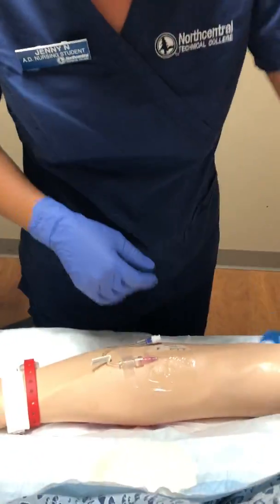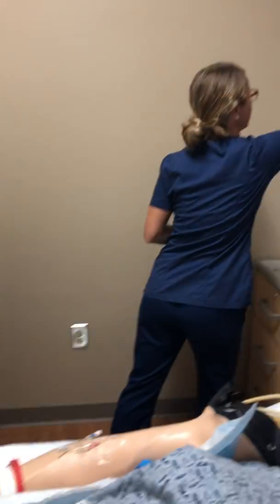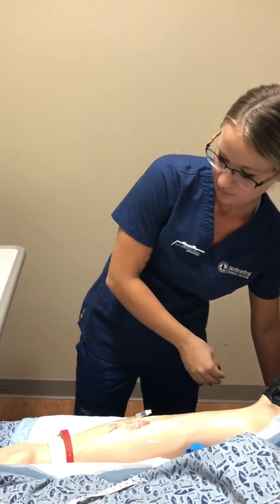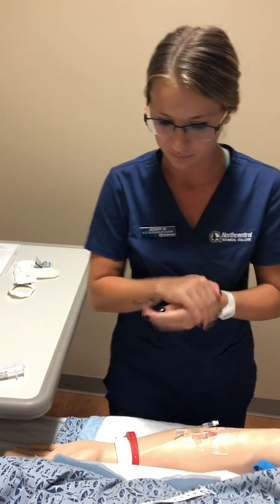Okay, turn the cap off. Make sure that's not more than 2 minutes. I have all my trash. I put my needle in my sharps container over here. I'm going to take my gloves off. Clean up my supplies. We'll toss all that. Wash my hands once more.